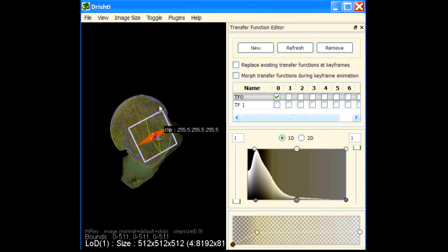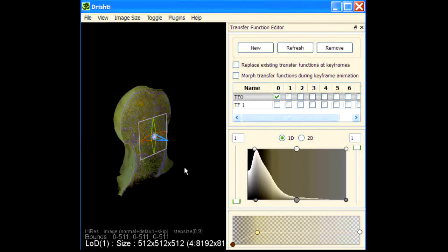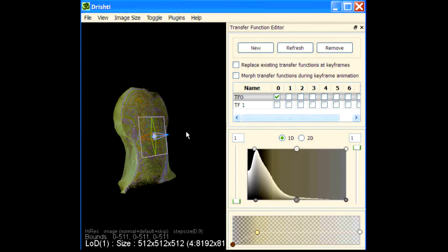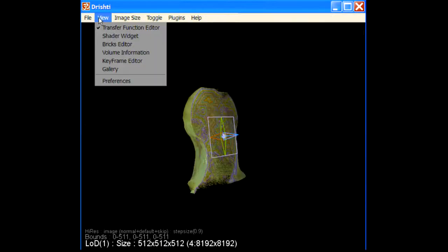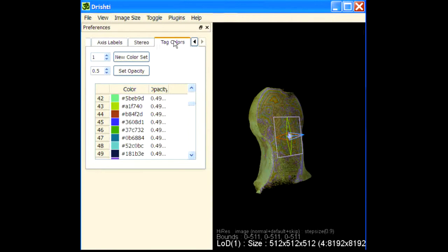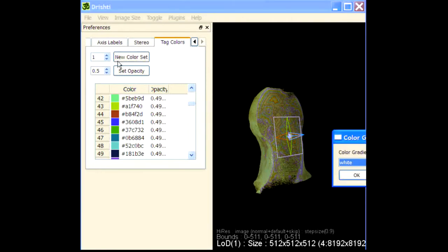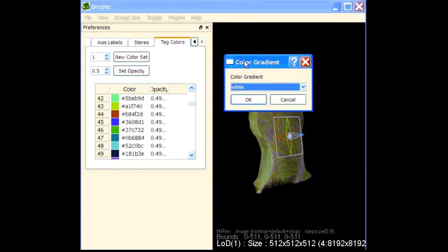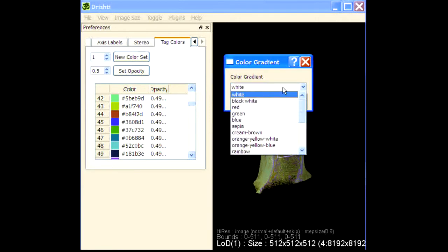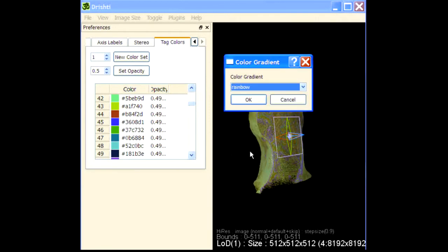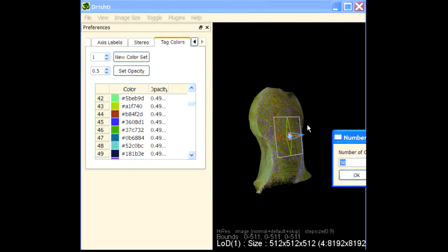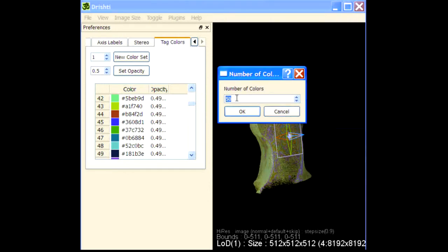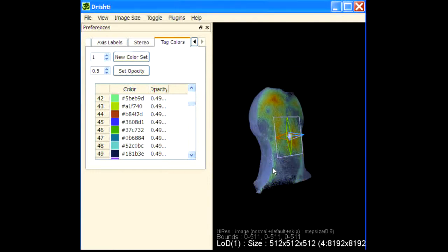We will change that. I'll just remove this transfer function here. We will change the tag colors. These are the tag colors. I'll just get a new set because these are random colors here and what I would like to get is a nice set of colors. Let's apply rainbow color gradient and we will generate maybe 30 colors using that color gradient.